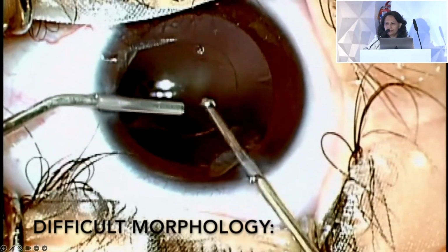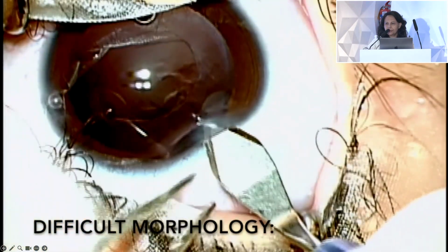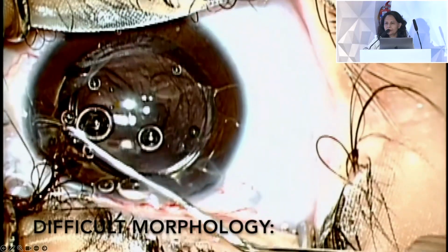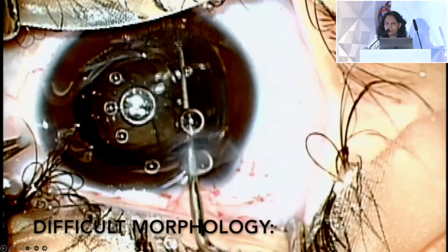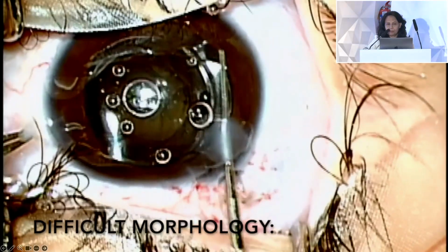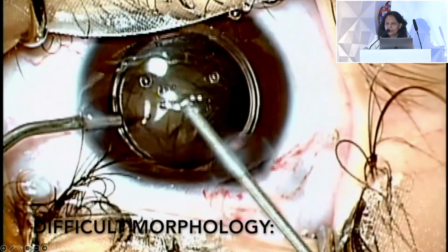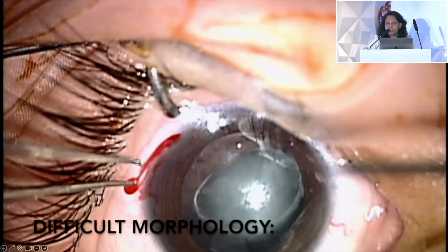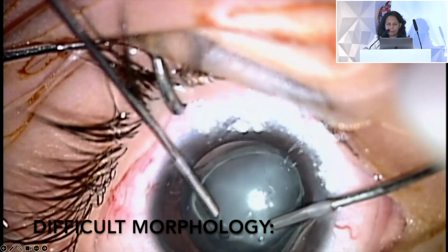Since there is already a large defect, if we have to put a lens in the sulcus, this is our customized lens that is produced in our own intraocular lens laboratory, and this is a one piece but has 4 limbs. So this is the lens that we put in the sulcus. Otherwise we can put other 3 piece lenses also.